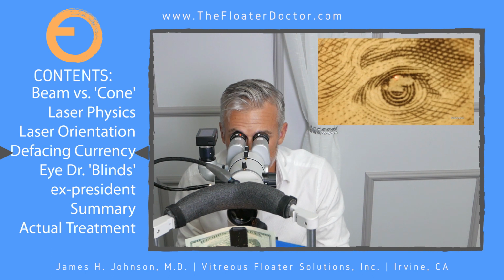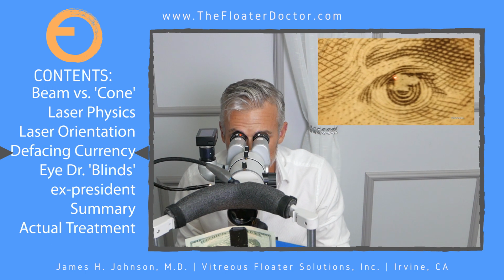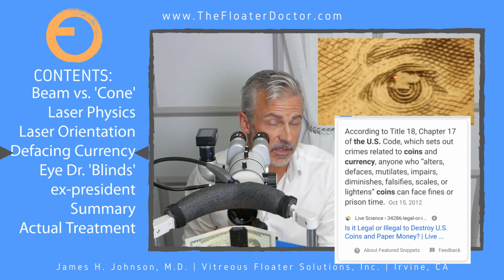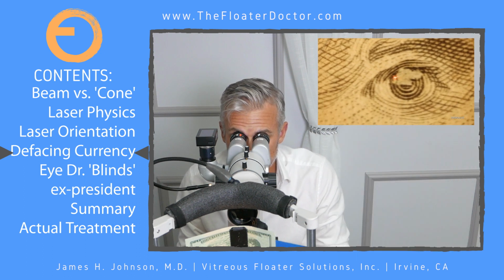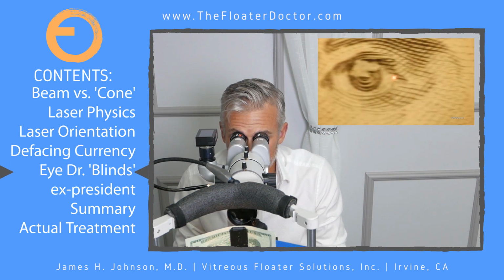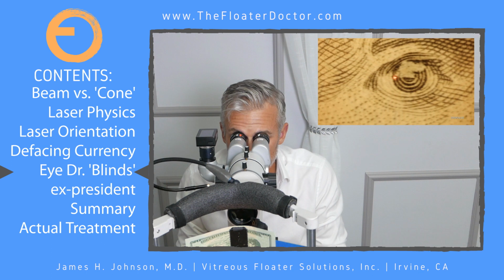Now, I kind of feel bad destroying the iris here, and I am, little by little, literally defacing this $20 bill. And that in the United States is illegal. You cannot deface. Well, I'm defacing, but just starting off with just a little area. But you can see that if I switch over to the other eye, poor Andrew is blind in this left eye now. So I can see the headlines: ophthalmologist blinds president. And that would be clickbait. Yeah, not very accurate, but clickbait.